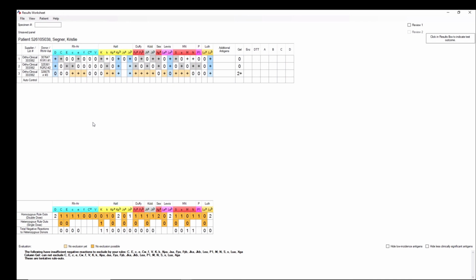But mainly it's the specimen number that's going to be used for putting your patient's sample into the machine, and there's a specimen number involved. And when you download something from a machine, you're going to have to put that specimen number in there to continue the work. So you have to use it when you're using a Vision, but you don't have to use it any other time. If you use it for an individual workup, then it needs to be continued for that individual workup, or you can have it required all the time. But probably you won't, and you only have to worry about it when you're using the Vision because we do have to match it there.